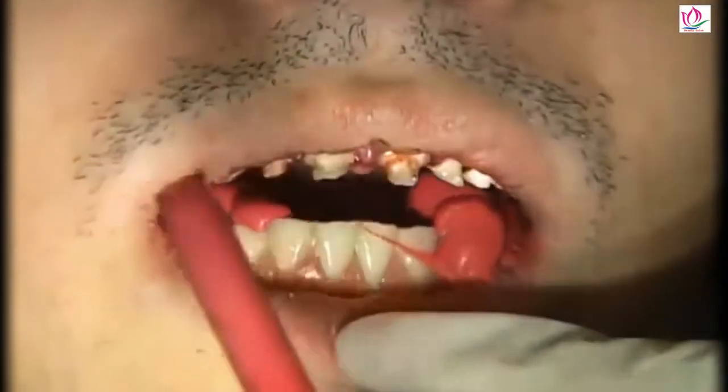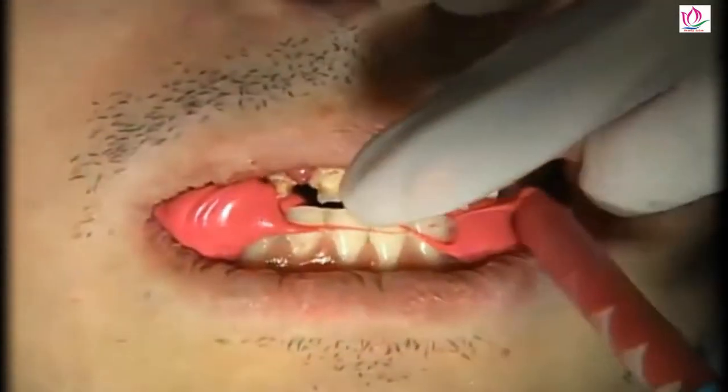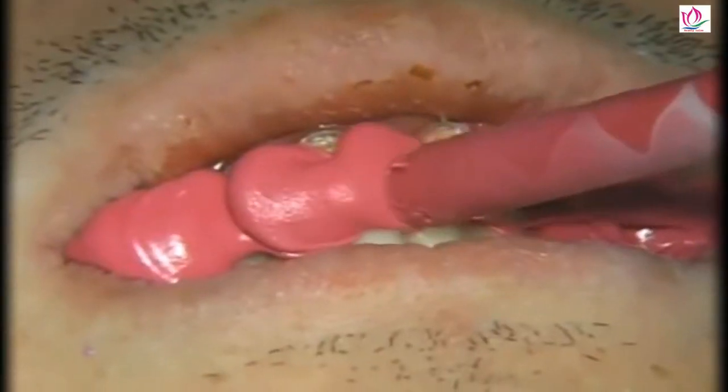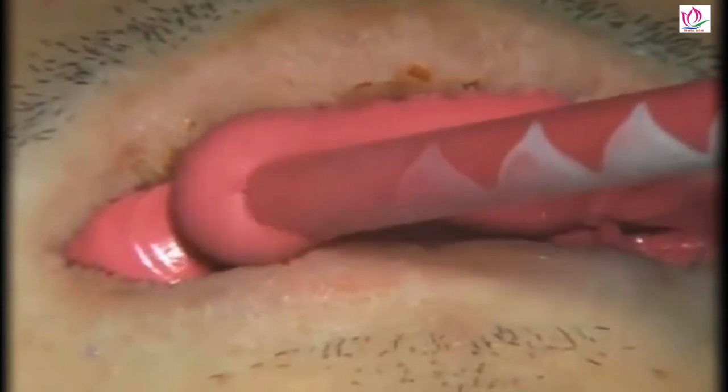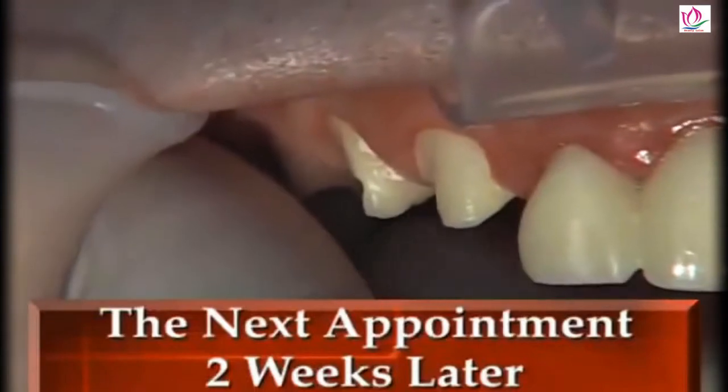Because we haven't prepared the second molars of the maxillary arch, we can take the bite registration without a jig or temporaries in place. We express it all the way around the arch except for the second molars and have the patient confirm he's in maximum intercuspation. Once the bite registration is set, we trim it with a scalpel so that the only indentations are where it contacts the incisal or occlusal third of the prepped teeth and the incisal or occlusal third of the opposing teeth. The bite registration should not contact any soft tissue, as that will cause it to be inaccurate.